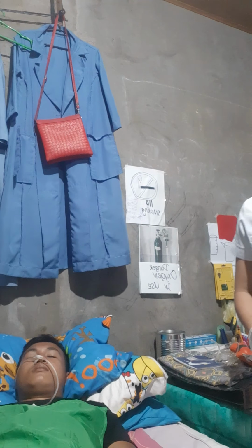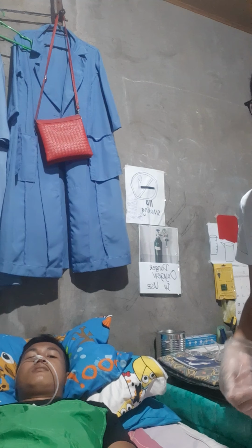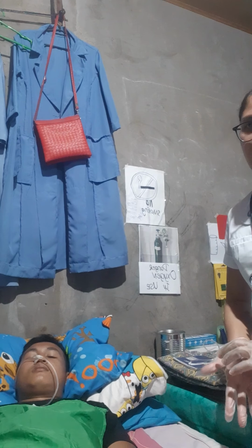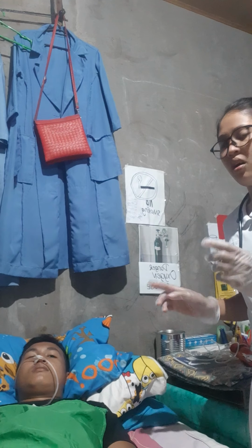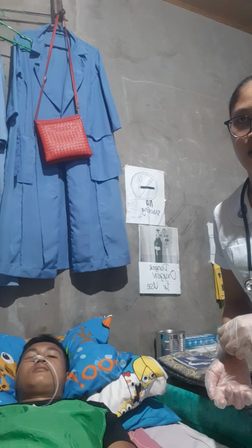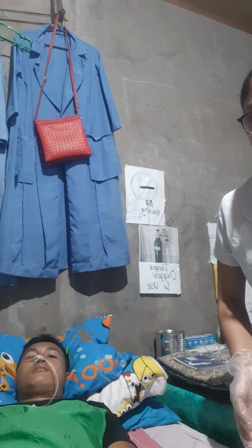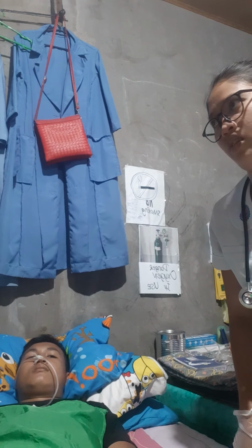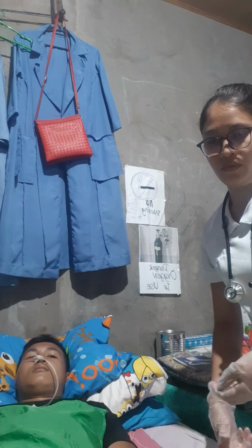And after that, after listening to the washing sounds, we are going to assess the residual content. So we need to aspirate all the contents of the stomach before we administer the feeding, to measure it, so that we will know later how much, or the measurement, that we are going to administer for feeding.